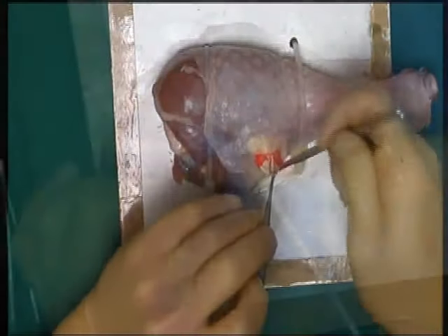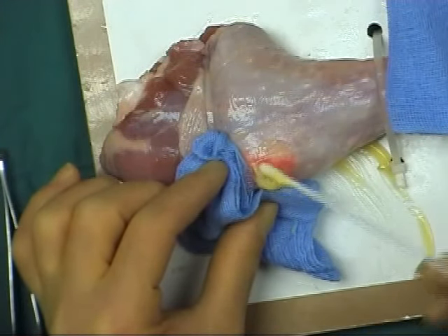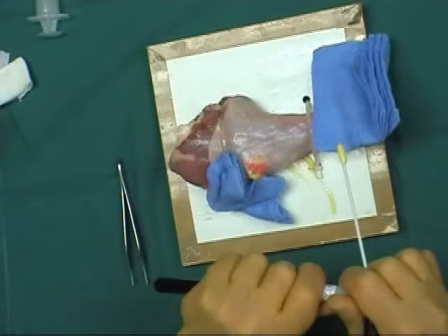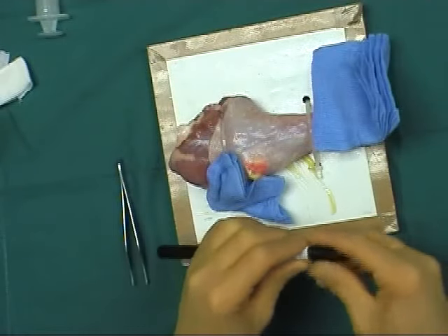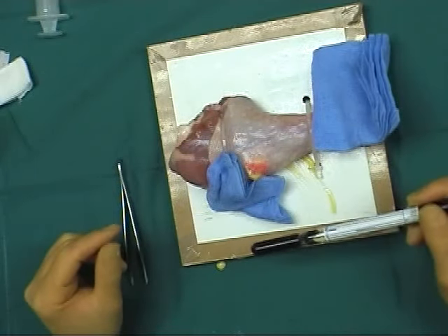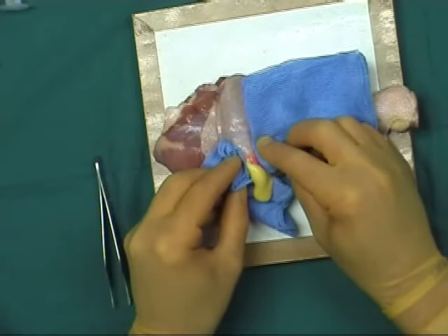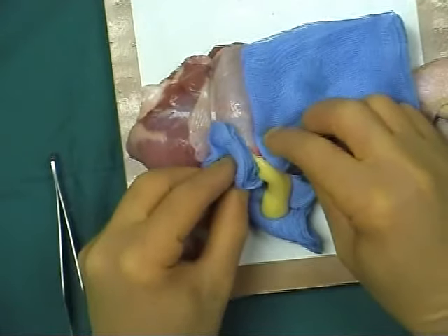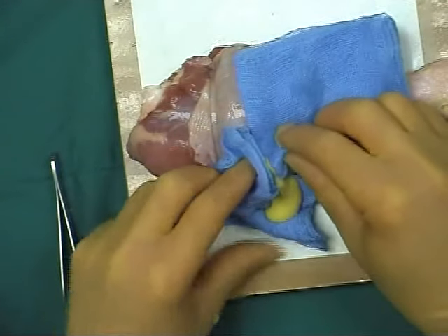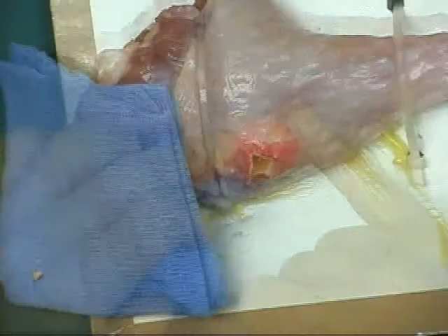At this point, a swab is taken, placed in a container and sent for culture and sensitivity tests at the microbiology lab. The next stage is to express the remaining pus using two-handed pressure and plentiful swabs to clear away the exudate. We are now left with a cavity and an overlying cruciate incision. It is sometimes necessary to excise the edges of necrotic skin tissue, as shown here.